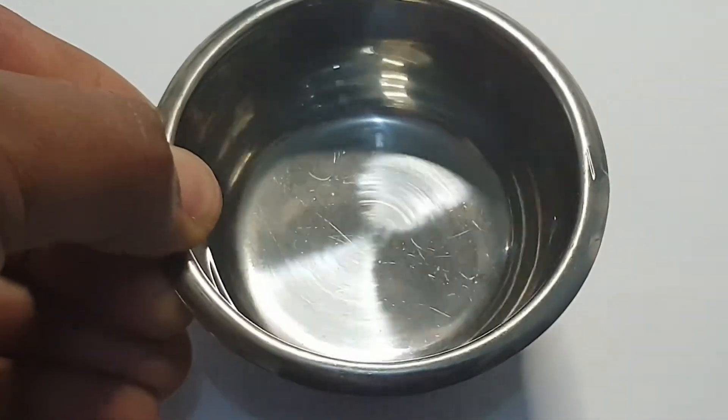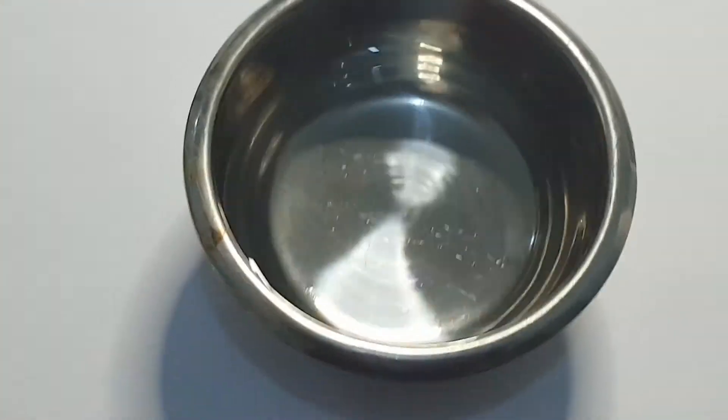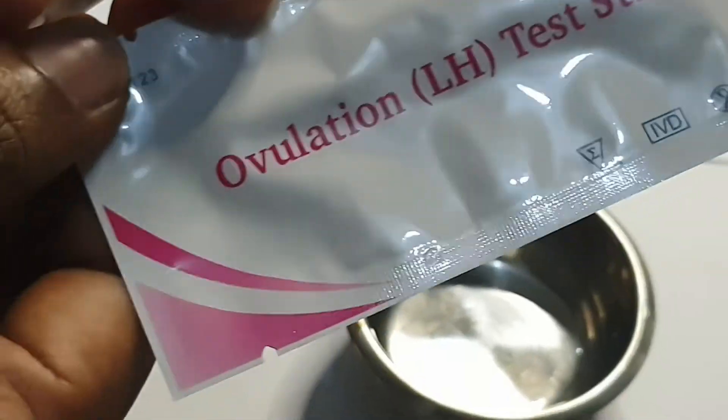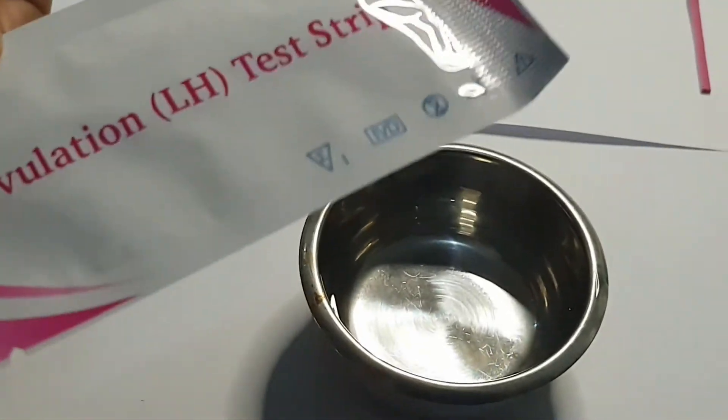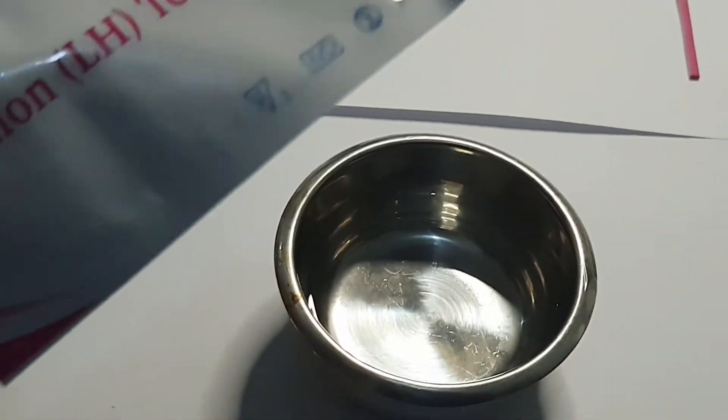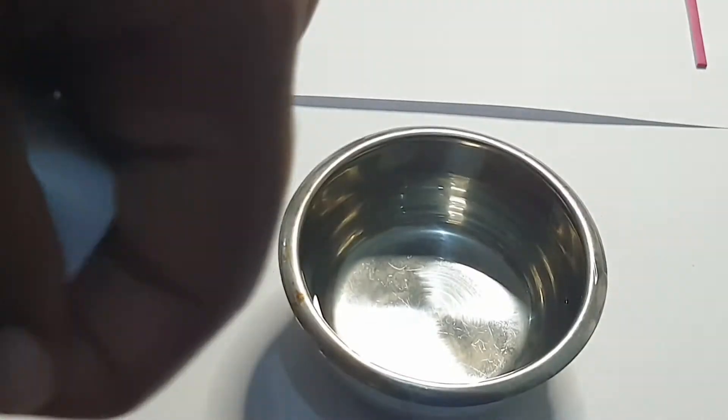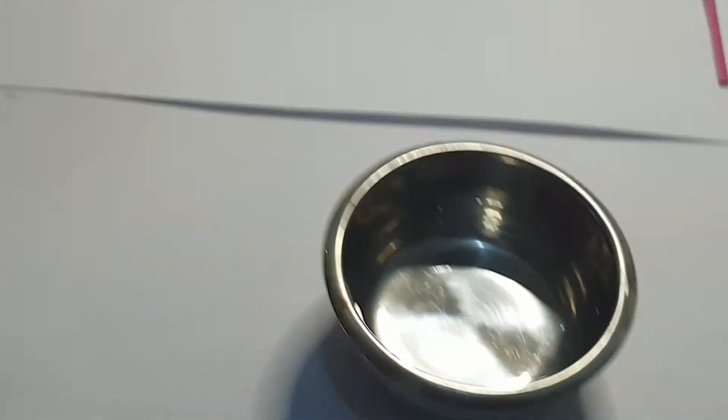First, you collect your urine in a little cup just like this. Next, you open the ovulation LH test strips gently like this from the edge.